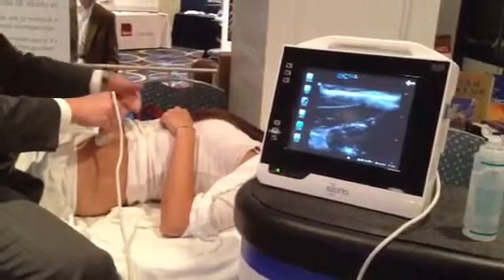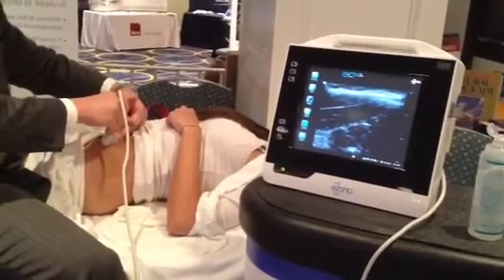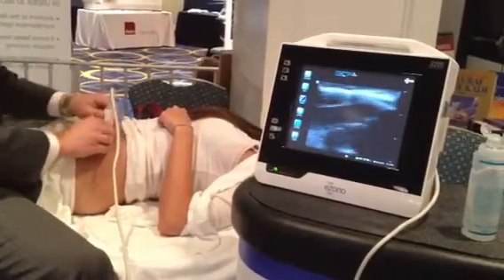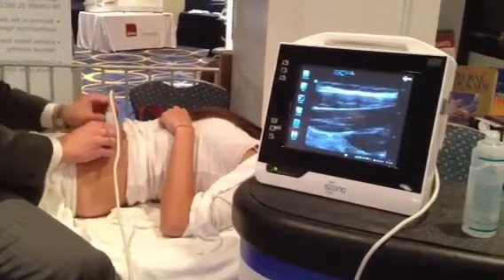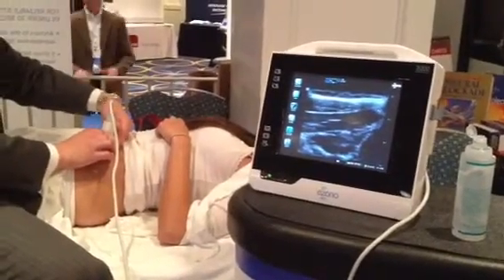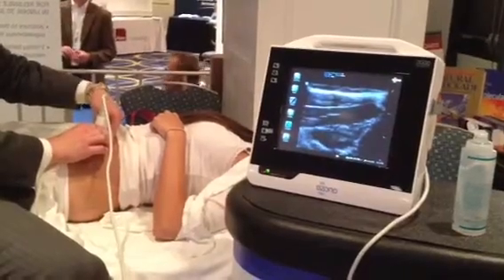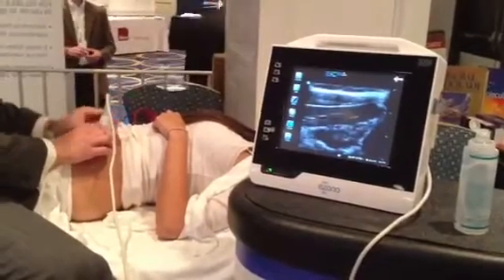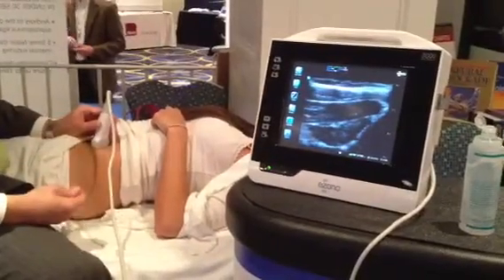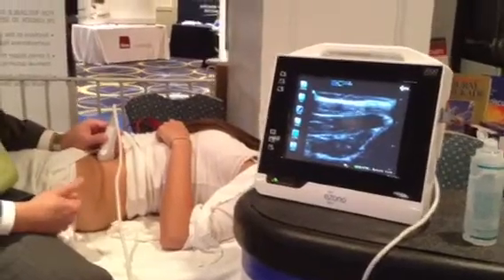The needle will then be inserted in long axis view right here. You can see on the ultrasound screen — if I push where the needle would insert, you'll see the upper left-hand corner of the screen where it would come in. You place the needle tip right in this area and complete the injection. This is the ilio-inguinal ultrasound-guided nerve block.